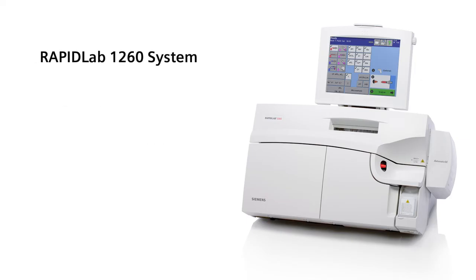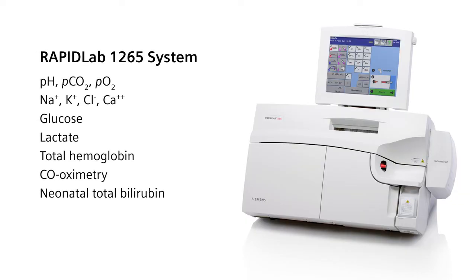The RapidLab 1260 includes all four electrolytes plus glucose and lactate in addition to the blood gas panel while the RapidLab 1265 system offers the full test menu including co-oximetry.